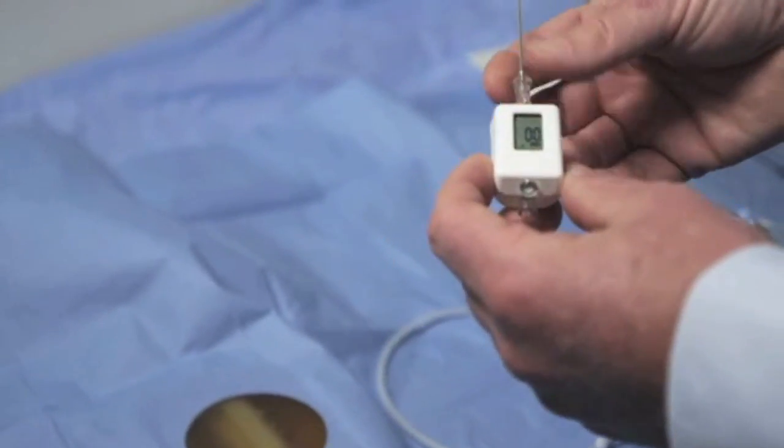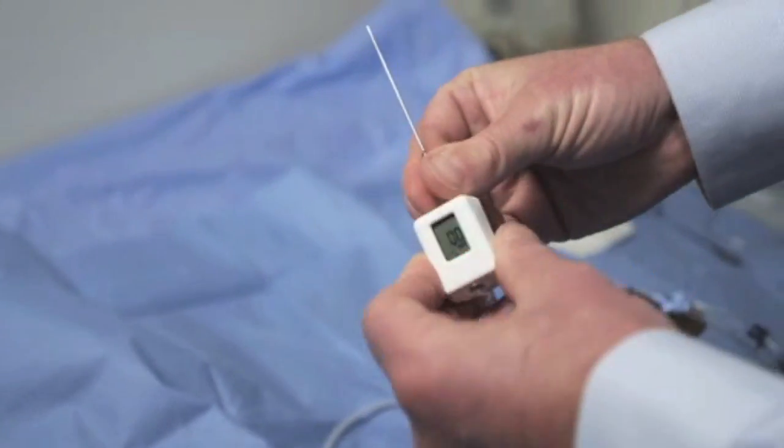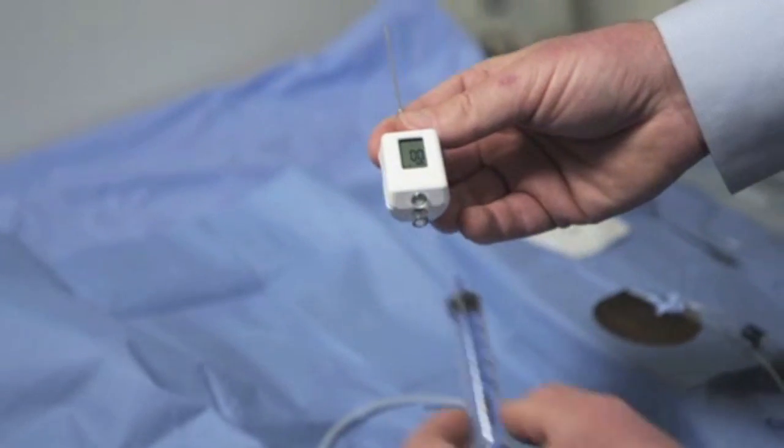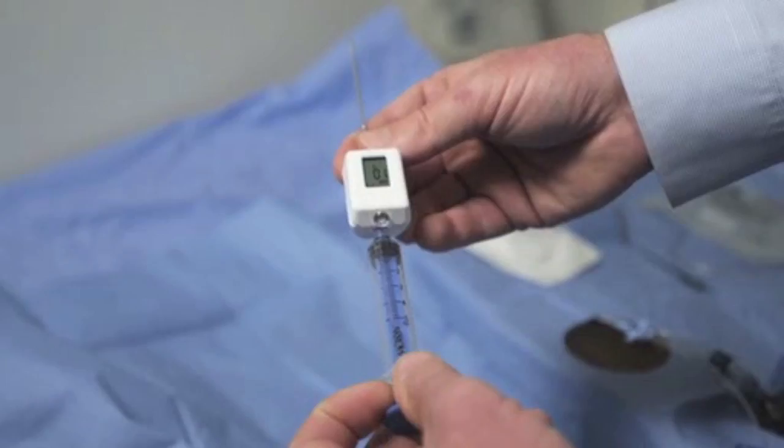Once the device is turned on, the finder needle, typically an 18-gauge needle, is attached to one end and a standard syringe to the other end of the device.